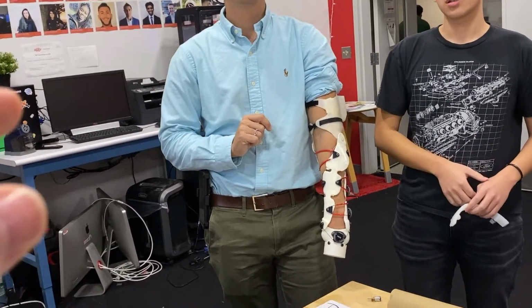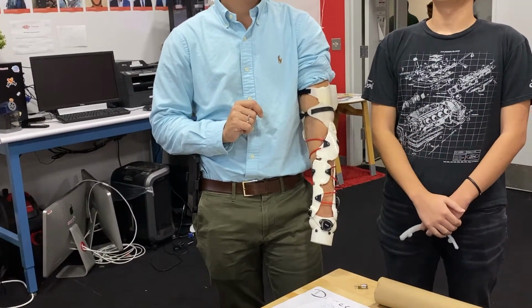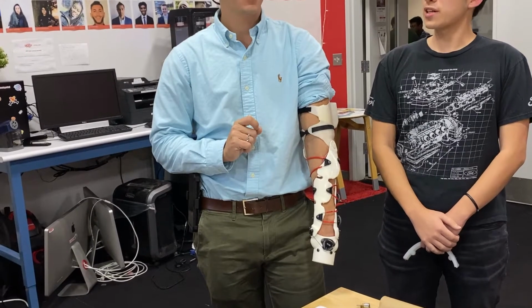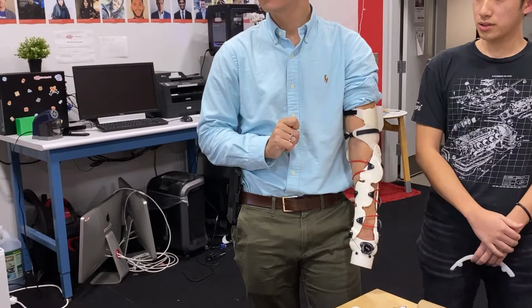Cheetah? Remind me what that is. Is that the NinjaTek, 82A softness? We looked at that. I think it's supposed to be 95, but because of how thin it is, it's a little bit softer. It was the only flexible thing we could print on the Ultimaker.